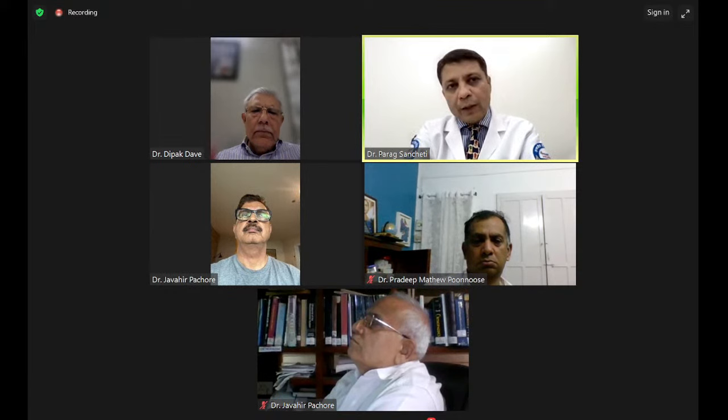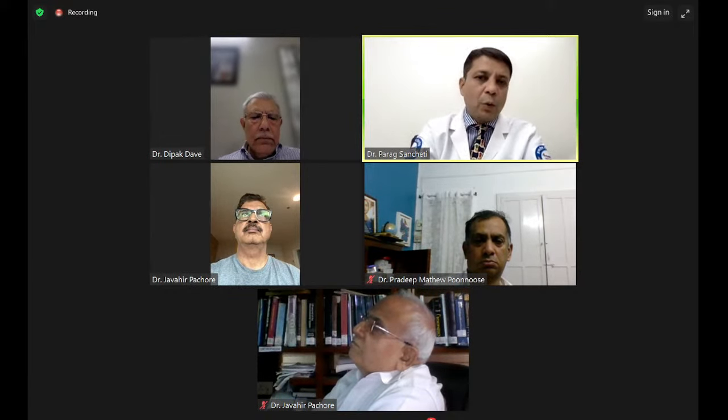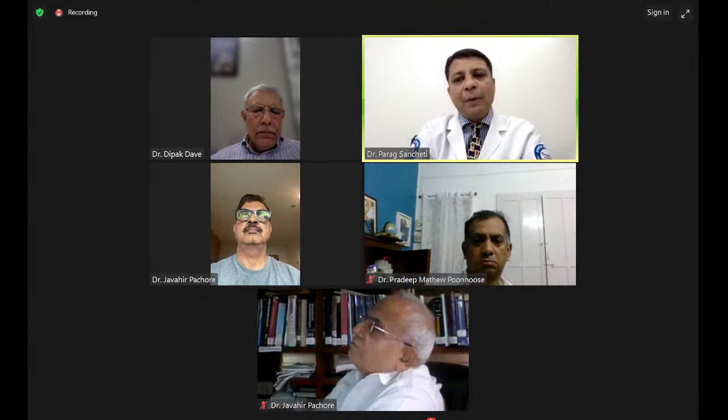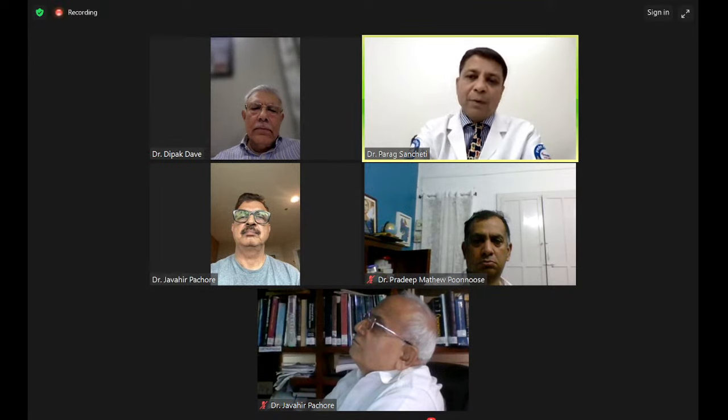Because if the bone quality is good and you get your alignment right, then there is no real indication to add the stem. But I would be happy to hear, Vikram, your indications to use a stem on the tibial side.